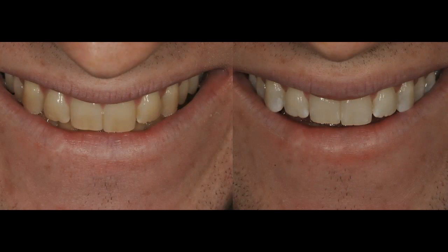And again, the progression from what you see on the left to what you see at the end result, and I'll show you the end result in a couple more slides, it took us maybe 15 days to get there. But again, if you think about this, if you do in-office bleaching and you spend 2 to 3 hours in your office, having somebody apply something to your patient's teeth, and all you get is a lot of dehydration, you'll probably get maybe one shade improvement on that chair.